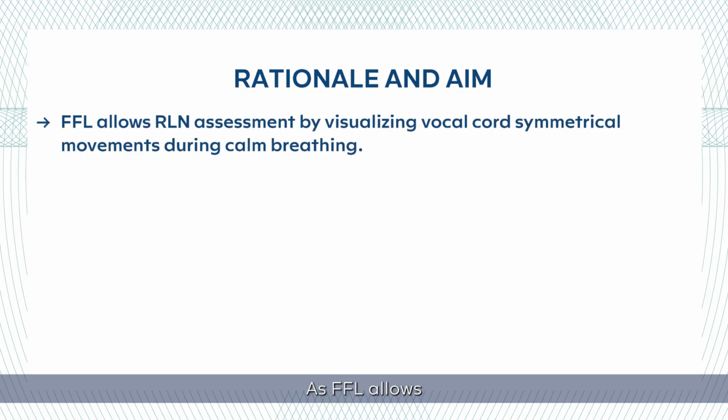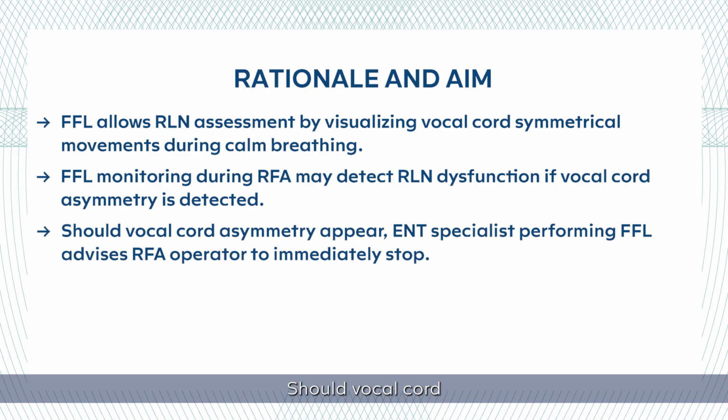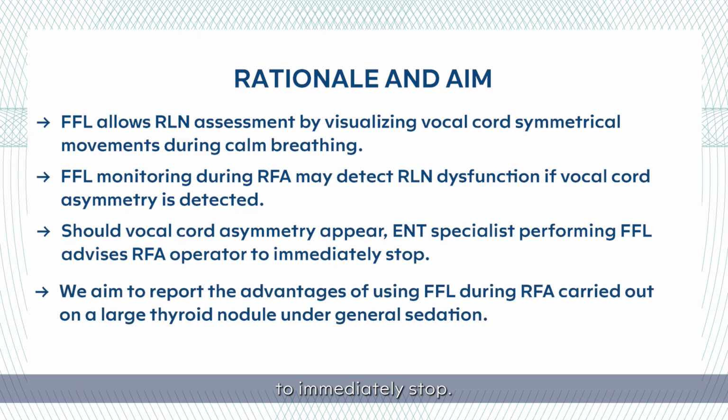As FFL allows RLN assessment by visualizing vocal cord symmetrical movements during calm breathing, FFL monitoring during RFA may detect RLN dysfunction if vocal cord asymmetry is detected. Should vocal cord asymmetry appear, the ENT specialist performing FFL advises the RFA operator to immediately stop.